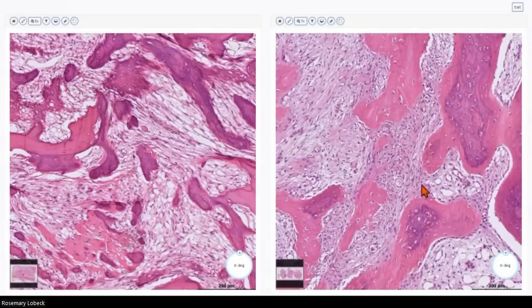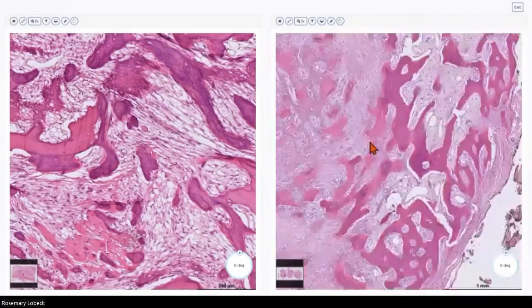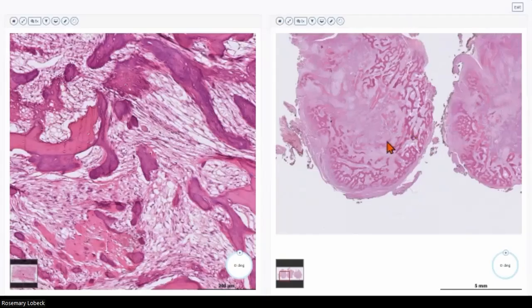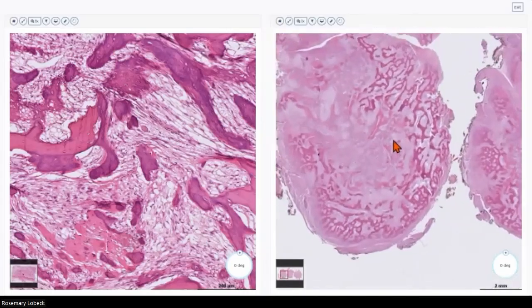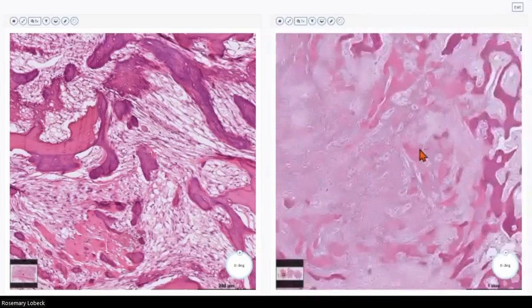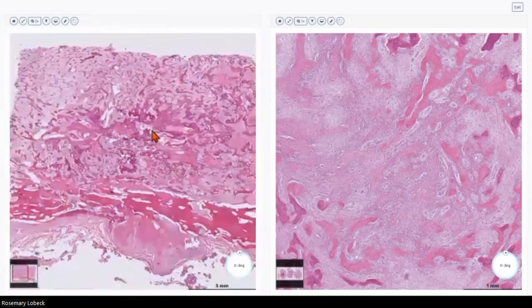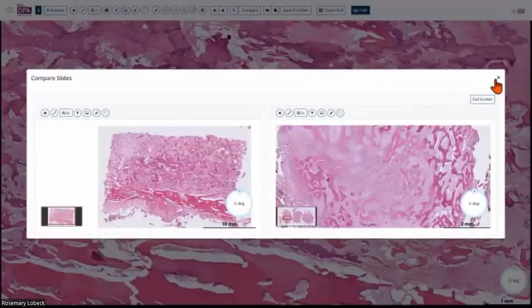Sometimes, even if you have full clinical information, myositis ossificans many times is just a lesion in the muscle, which is very close to the bone, which is what parosteal osteosarcoma does, right? So it's going to be very similar. However, there is one escape route in this particular situation, because if you pull back, you will see in a myositis ossificans, as most of you know, there's going to be a distinct zonation phenomenon, right? So you can see that phenomenon over here. So you see more mature bone on the periphery, and then less mature bone in the middle of the lesion, and then just a fibroblastic proliferation in the center. So if you pull back on the low-grade osteosarcoma, it's going to be irregular bone everywhere. There is no zonation at all, right? So in a larger specimen, this is a very, very useful clue to make the distinction between these two lesions.